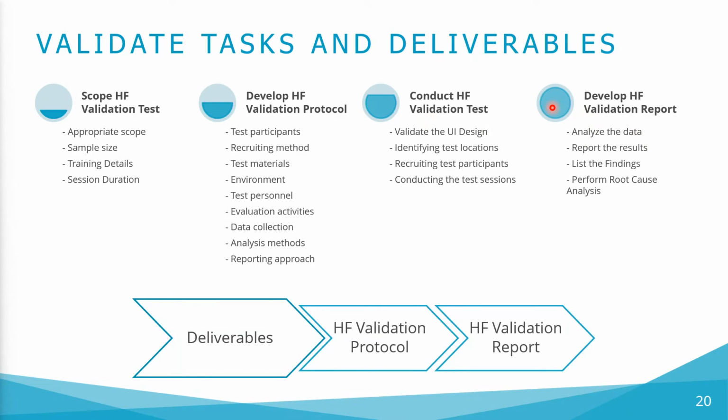We should present findings related to critical tasks in a tabular format, matching any of the recent guidance on HF validation data reporting. For all findings not related to critical tasks, you can describe the issues more briefly, that is, in a summary paragraph, along with the participant reported root causes.